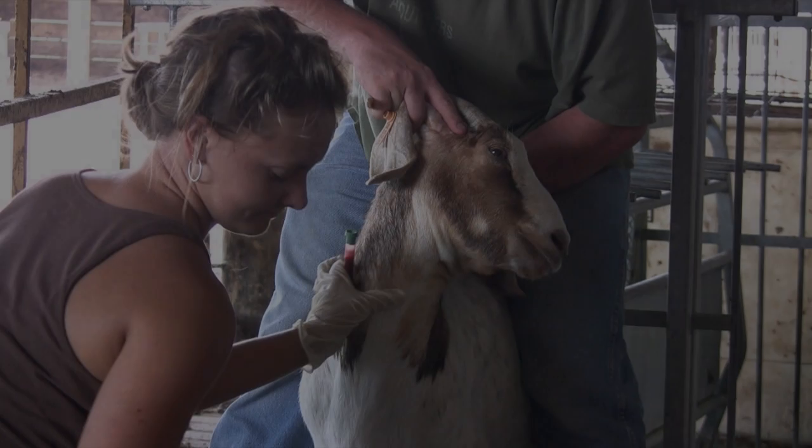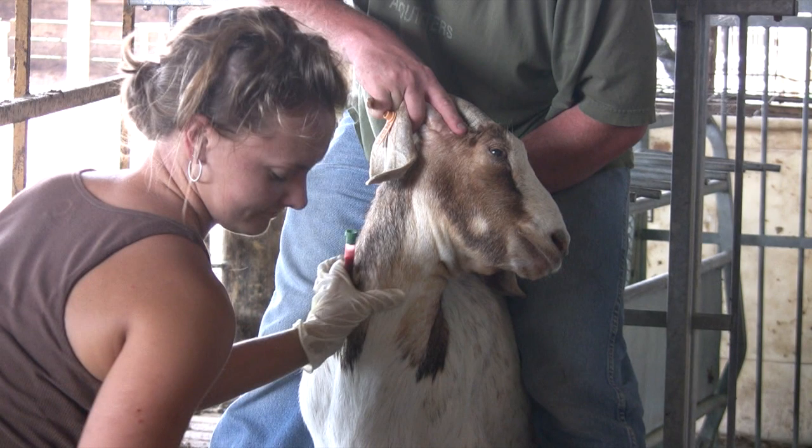After the needle has been removed from the skin, press your fingertip over the area for about 30 seconds where the needle was inserted.